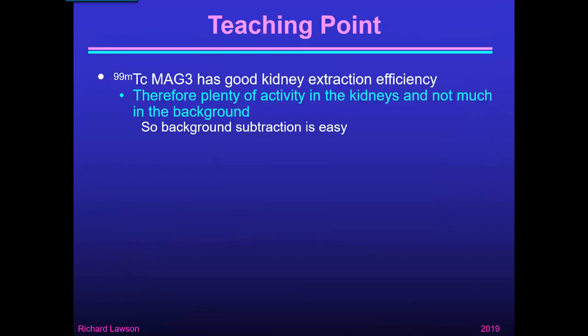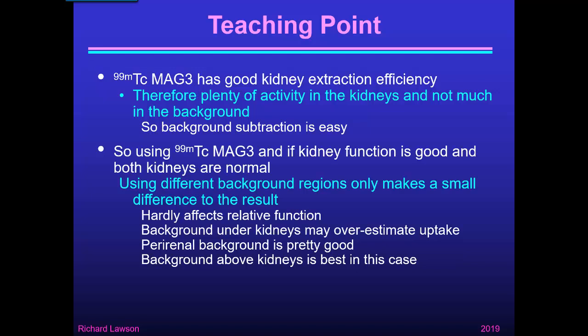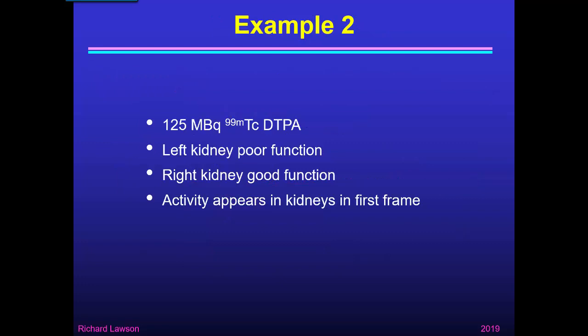The teaching point from this study is that Technetium-99m-MAG3 has good kidney extraction efficiency, therefore there's plenty of activity in the kidneys and not much in the background, so background subtraction was easy for this particular patient. When using MAG3 with good kidney function and both kidneys normal, using different background regions only makes a small difference — it hardly affects the relative function. But here's another case which shows that it does matter.